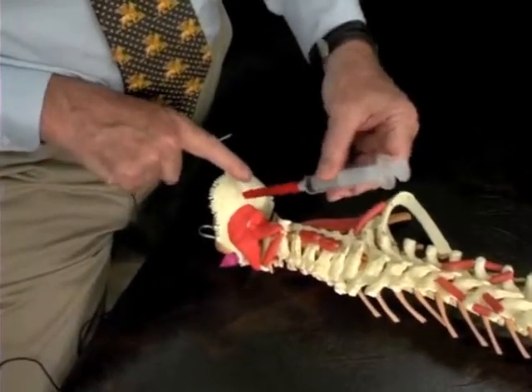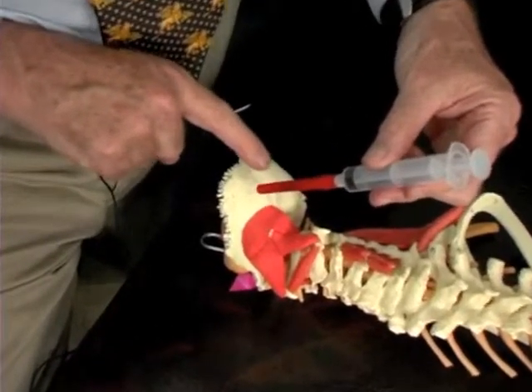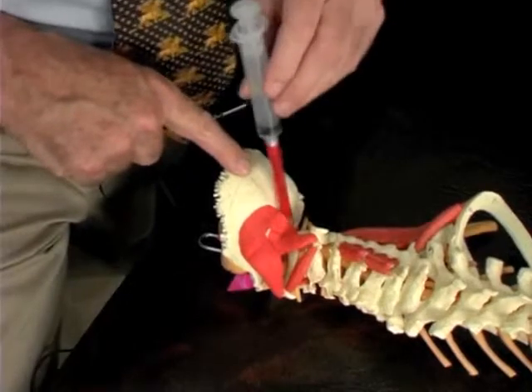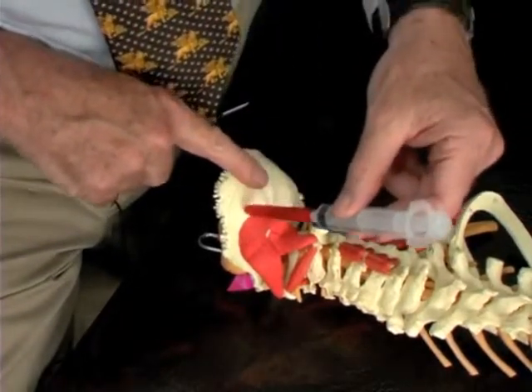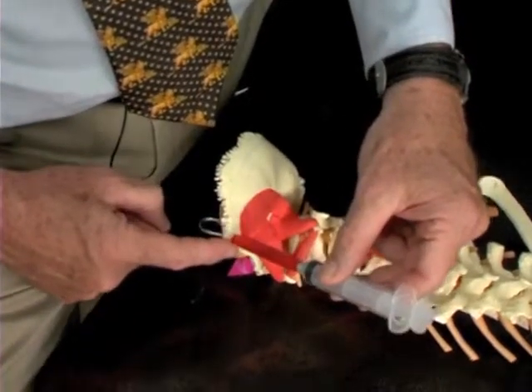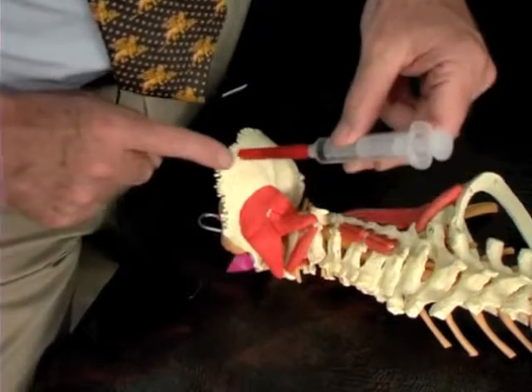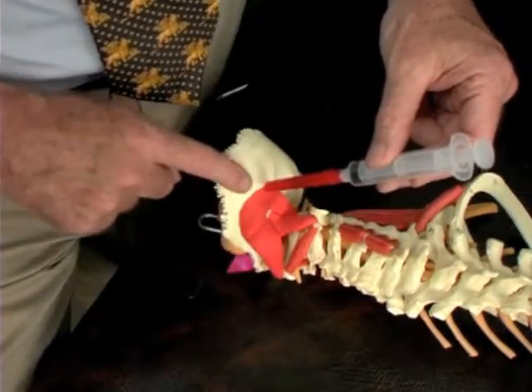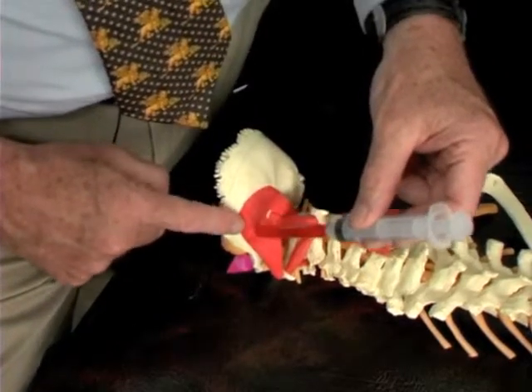The injection should not be in a caudal direction but should be in a cranial direction, again about 45 degrees. We remember to keep our finger just below the inion in that no man's triangle so we don't put the needle in that area. We then come along the nuchal ridge — the attachments of the trapezius — working our way down to near the mastoid process. Our next line goes into the capitis and splenius muscles, coming along with a second line along that nuchal ridge.